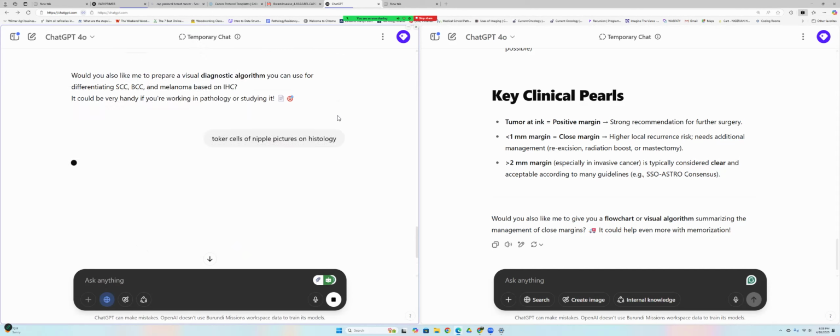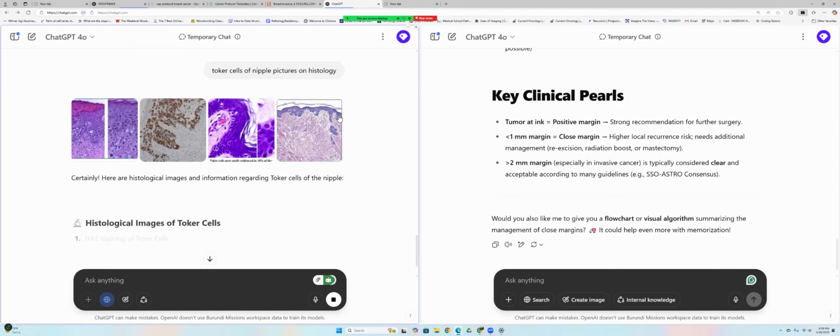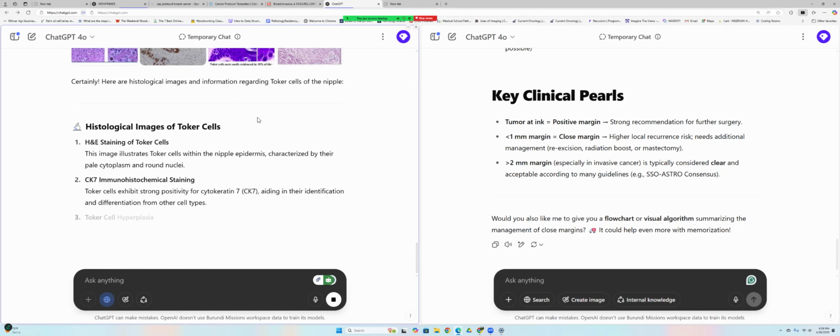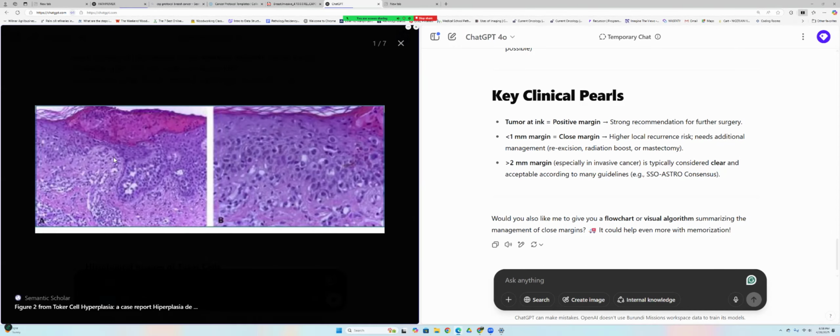The example mimics Paget disease of the nipple. But how do you differentiate them from Paget disease of the nipple? They lack pleomorphism, because they are normal cells. They are not neoplastic cells.